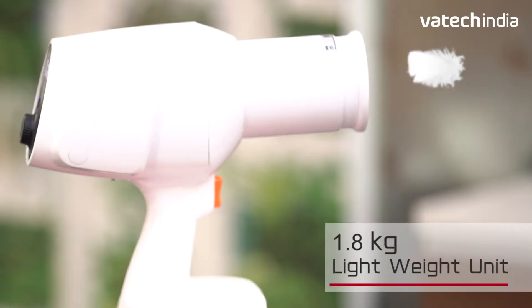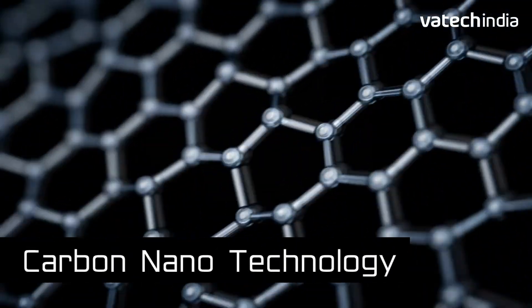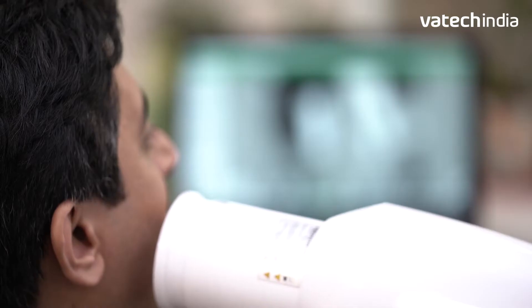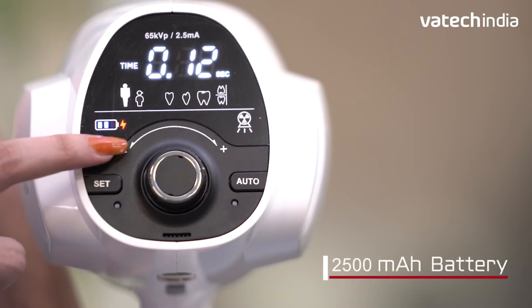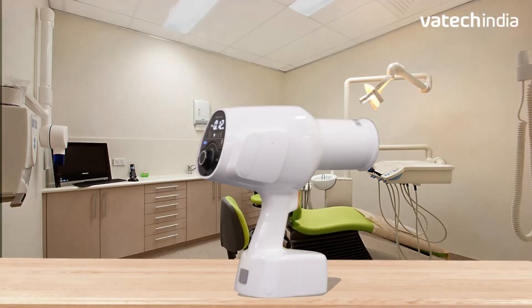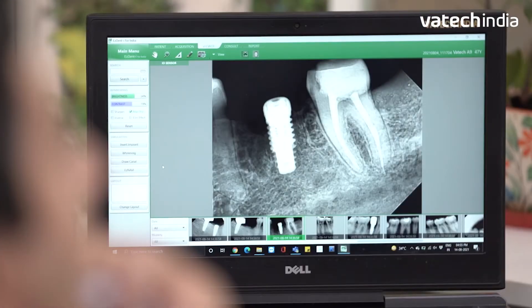The lightweight unit of just 1.8 kg is designed with carbon nanotechnology, making it easy to handle and offers stable positioning for optimal high image quality. With the all-new 2500 mAh battery — largest in the segment — EZ-Ray Air Plus performs longer on a single charge, giving high-quality X-Ray images and zero disturbance in focus.